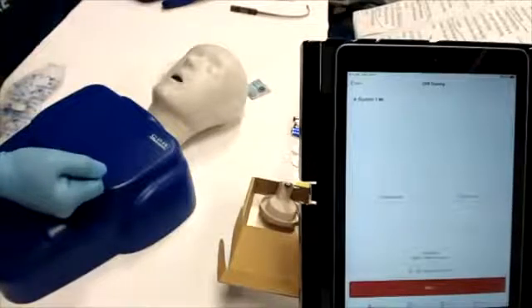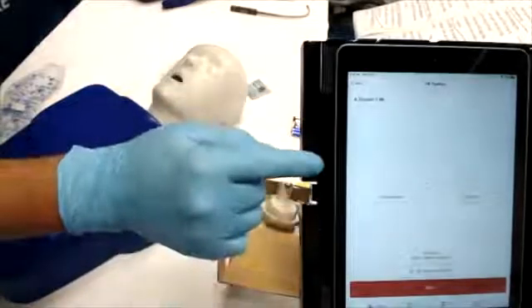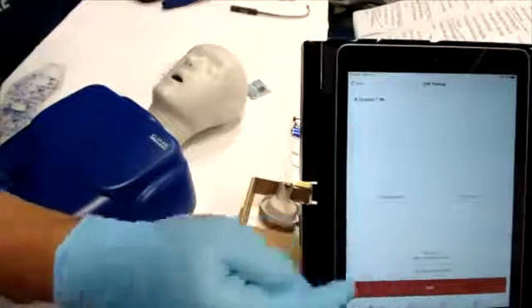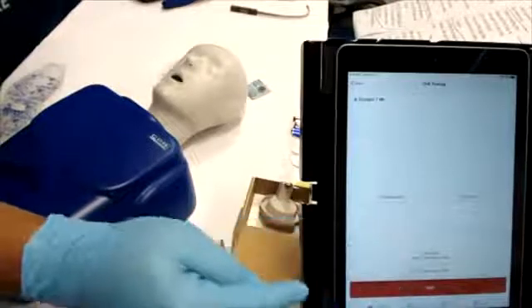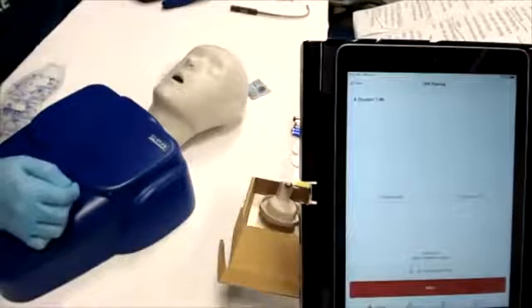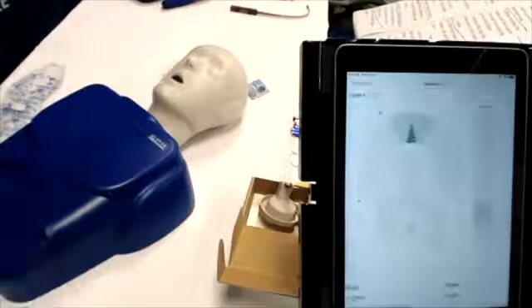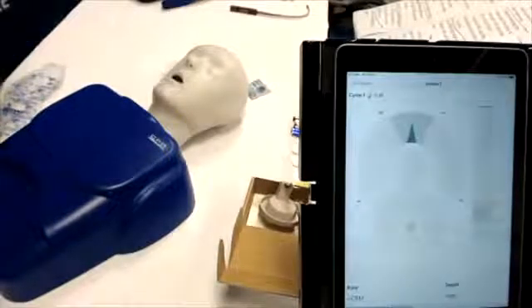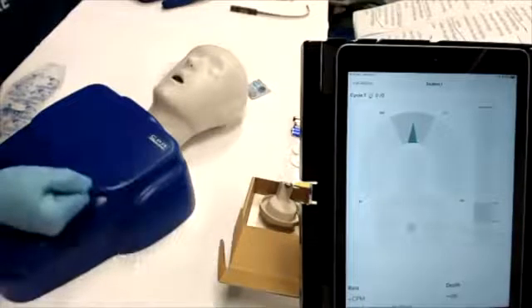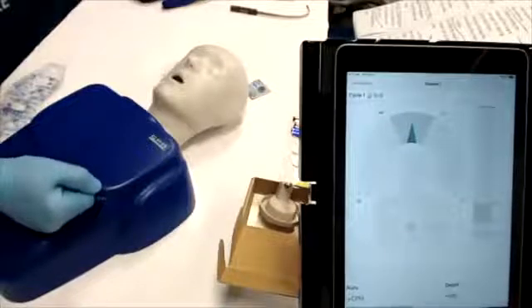At this time, the instructor can select the cycle option, hands only, or compression and ventilation. Find this under the training icon. The gray shaded button is the option selected. The link icon gives the instructor the opportunity to add more mannequins and students, up to 6, without disrupting in-progress sessions.